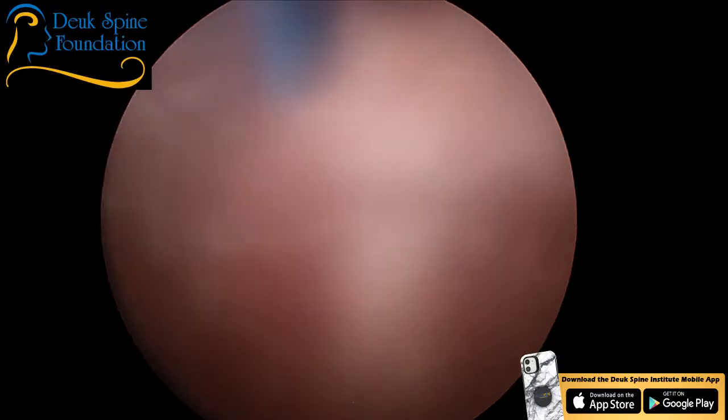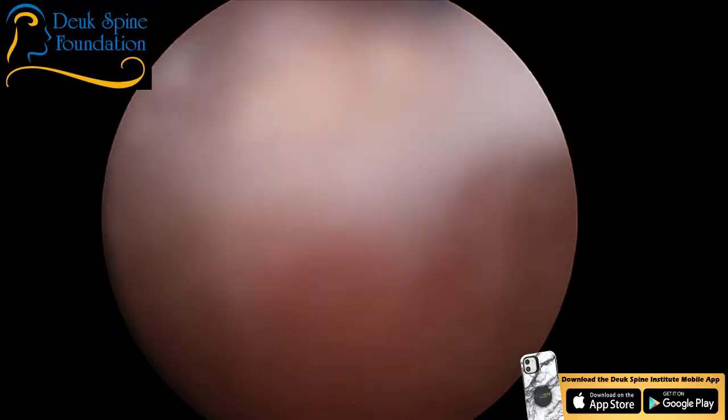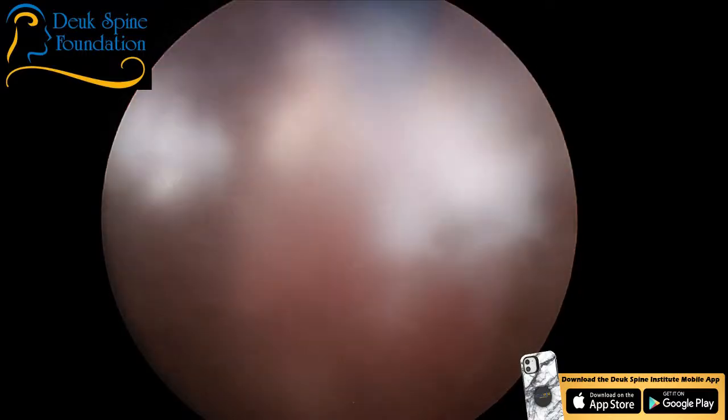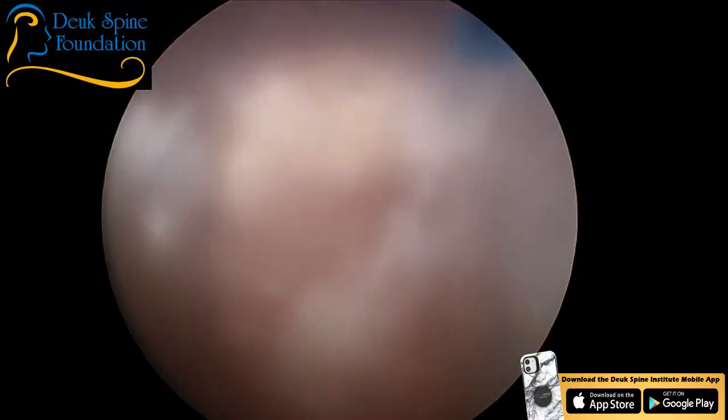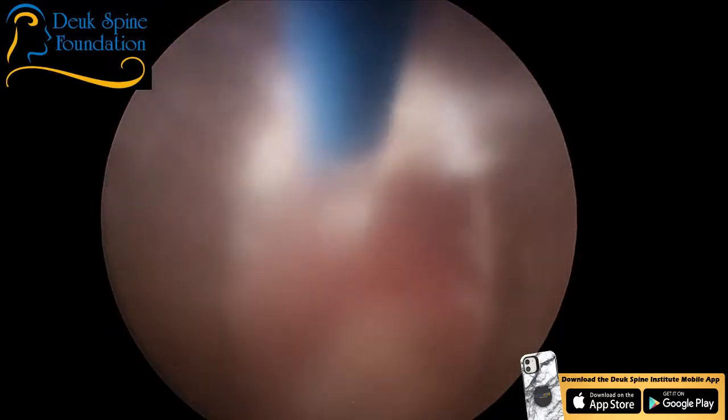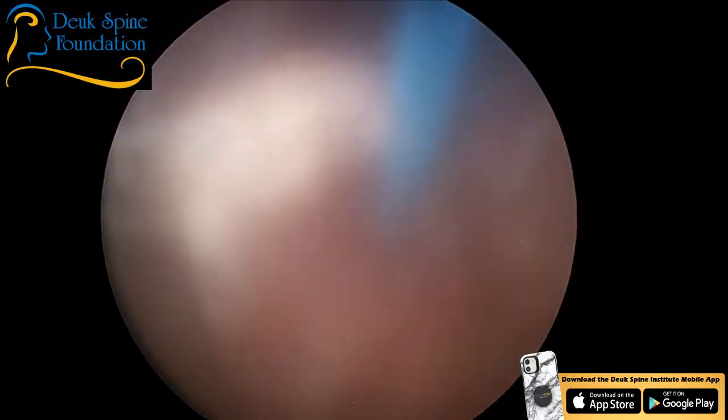This is L3-4, by the way, in case you're wondering. We were able to successfully enter. And that's a lot to do with our anesthesiologists, believe it or not. So if you're going to start doing these surgeries in the future, if your patient is awake enough, they're going to be literally tightening up their back muscles, squeezing, trying to roll around to get away from the pain.